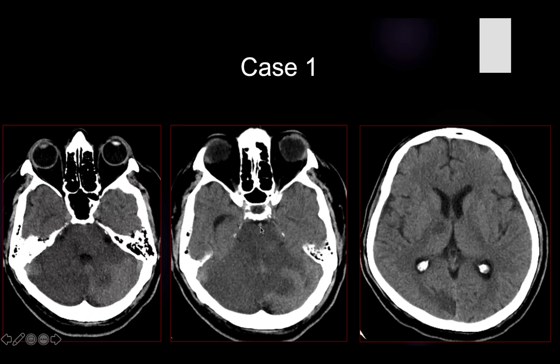that the basilar artery is hyperdense. So this is an example of the hyperdense vessel sign, which represents an acute infarction or acute thrombosis of the basilar artery. It is more commonly seen in the MCA, which is called the MCA dense sign. Here it is occurring in the basilar artery, and it is called the basilar artery dense sign, similar to the MCA dense sign. It is the same mechanism and same phenomenon. In acute thrombosis, the artery becomes hyperdense on non-contrast CT.